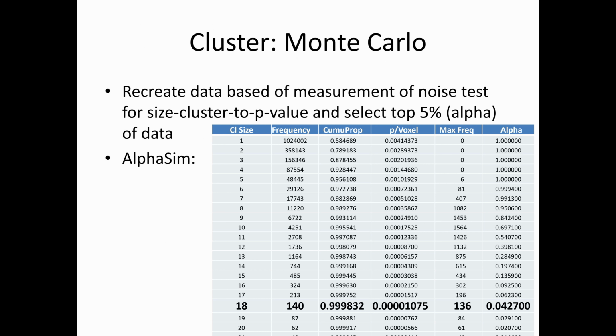If you adjust, like with this one, this is how many voxels are significant when you set the voxel level at 0.01. If you set this to 0.0000001, this table would shrink up to the top, right? That'd only be a couple times that you're getting more than 1 or 2 voxels contiguous.